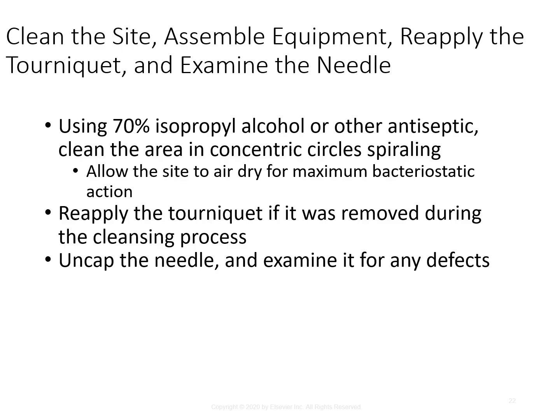All right, so cleaning the site and getting your equipment ready. You are going to use 70% isopropyl alcohol or another antiseptic to clean the area in circles. Allow the site to air dry for maximum bacteriostatic action. You do not want to blow on it to dry it. And if you need to repalpate the vein, like retouch the vein, the area must be cleaned again before the venipuncture. So as that site is drying, you're going to assemble the rest of your equipment and get it ready.